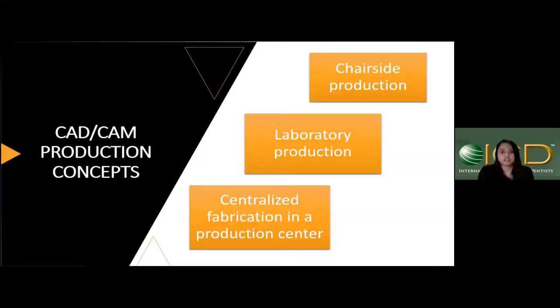For the CAD/CAM production concept, we can divide it into three. First is chair-side production, where the whole CAD/CAM system is in the dental clinic, so from scanning and designing to milling, it's all in the clinic. The second one is laboratory production, where the scanning is in the dental clinic, and the designing and production are in the laboratory. The third one is centralized fabrication, where we scan and design in our clinic, and then we send the data to the fabrication center to fabricate the restorations.